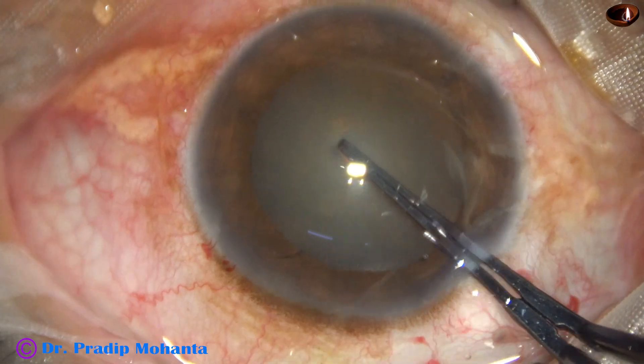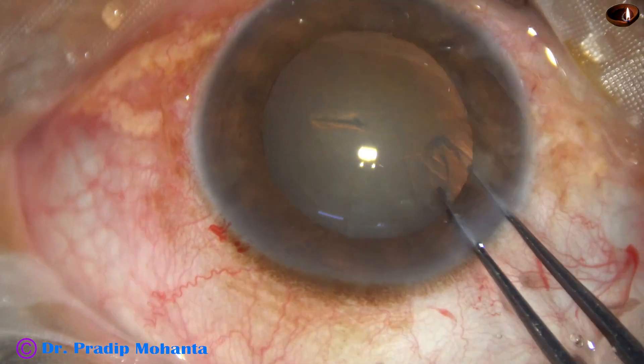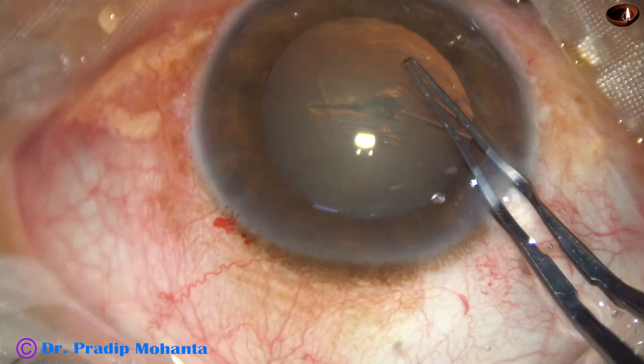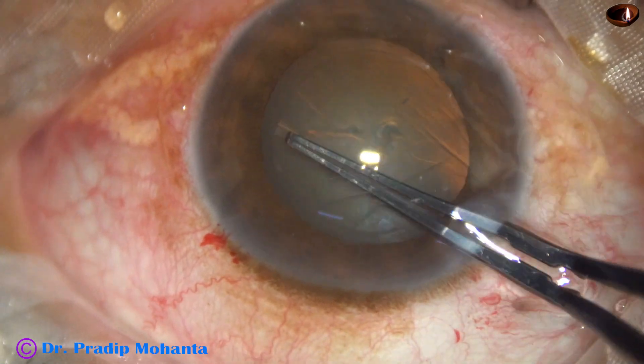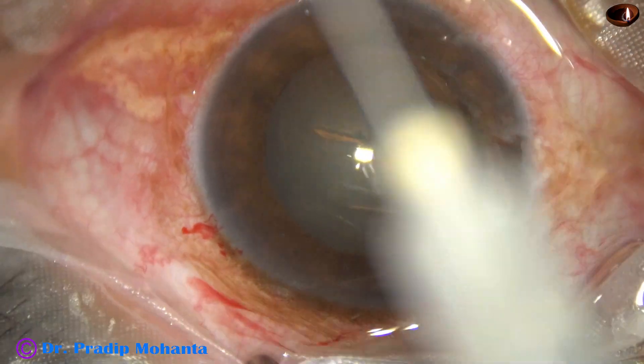Capsulorhexis is done with the help of utrata forceps. When we use utrata regularly, it takes less time than the needle.